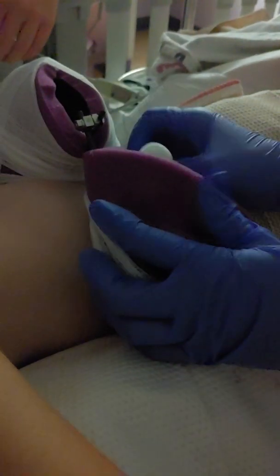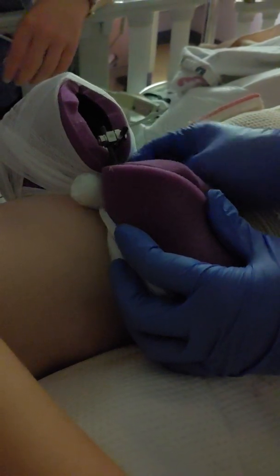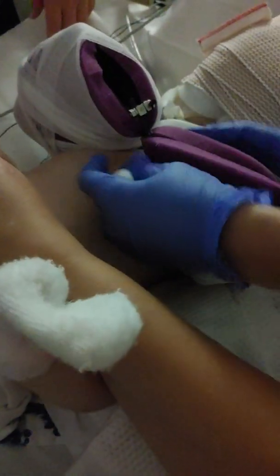The other thing that might happen over the next couple weeks is these guys can loosen a little bit sometimes, so I'll just get a wrench from downstairs and come up and we can just tighten them if we need to. Okay, cool. So if something seems like it's wiggling, just let me know and we can tighten those up again. But that's pretty normal too. And towards the end, I bet that last week it'll almost certainly happen. Okay, cool.